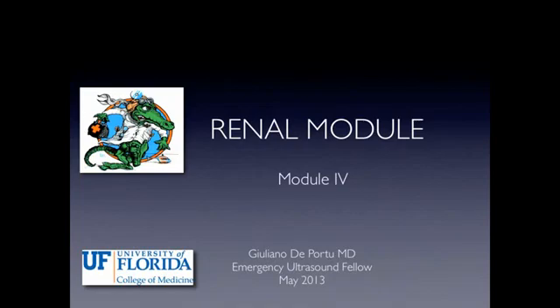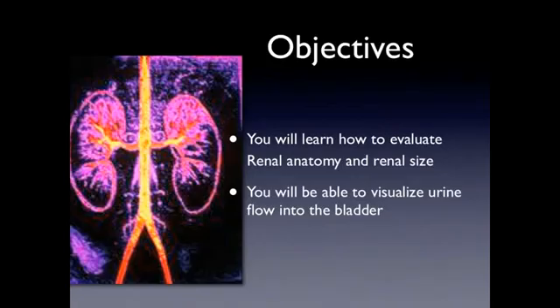Welcome to the University of Florida College of Medicine ultrasound module. Today we're going to do the renal module. You will learn how to evaluate renal anatomy and renal size using ultrasound, and you're going to be able to visualize urine flow into the bladder using Doppler.